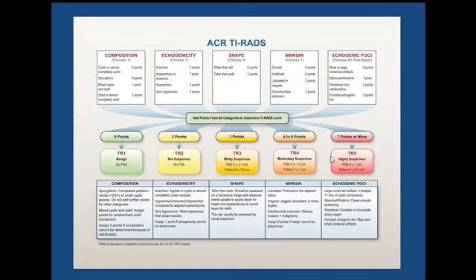and they gave us the TI-RADS chart. So here I have the TI-RADS chart, and all our lecture today will be about this chart. So if we get familiar with it, after that we will be able to apply the TI-RADS. And actually this chart, we recommend to put it in your ultrasound room, in your reading room, so you can memorize it when you are scanning the patient.